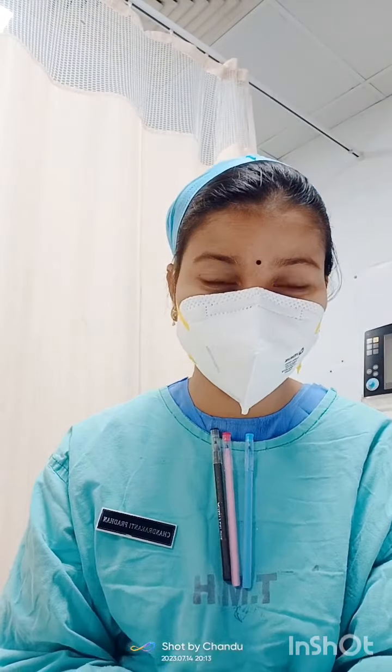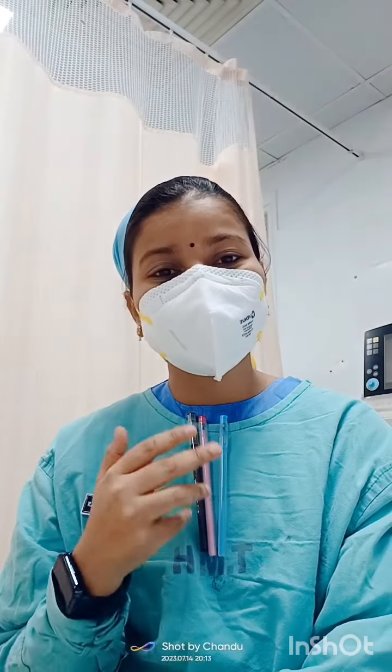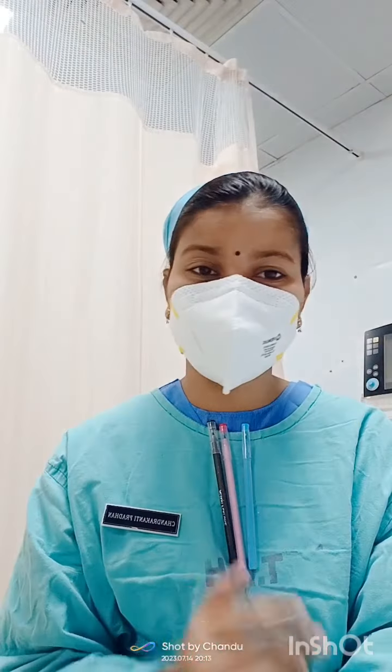What happens when you accidentally do not choose the synchronized button? The machine delivers the shock to the patient, but complications can develop, like unstable tachycardia, VT, VF, or the patient may develop sudden cardiac arrest. So you have to always remember that when you are using cardioversion, you have to choose the synchronized button properly.